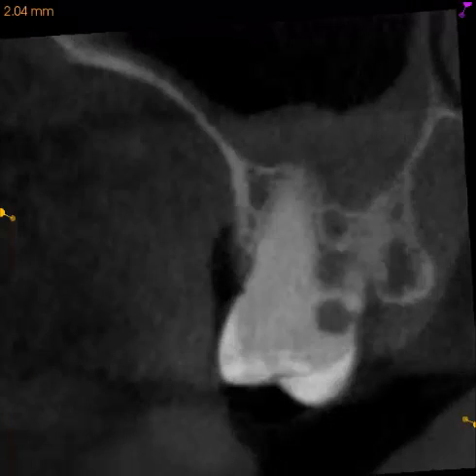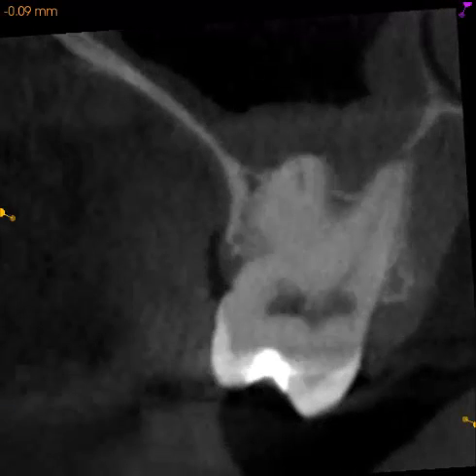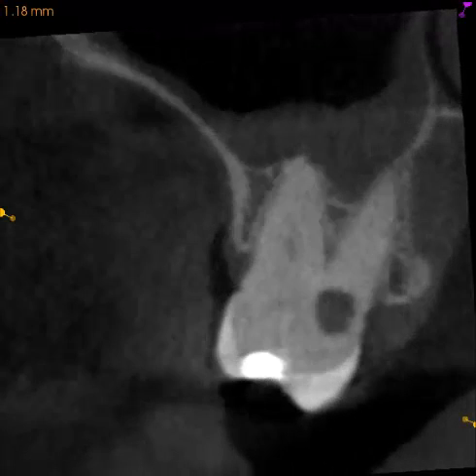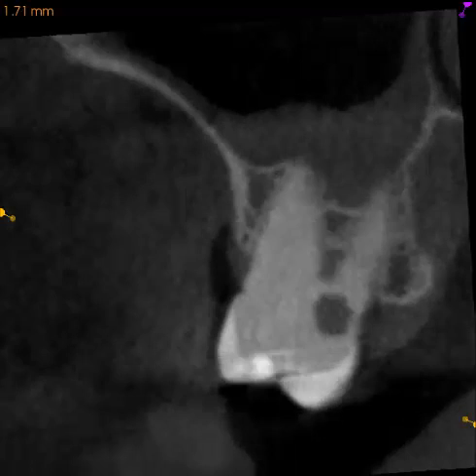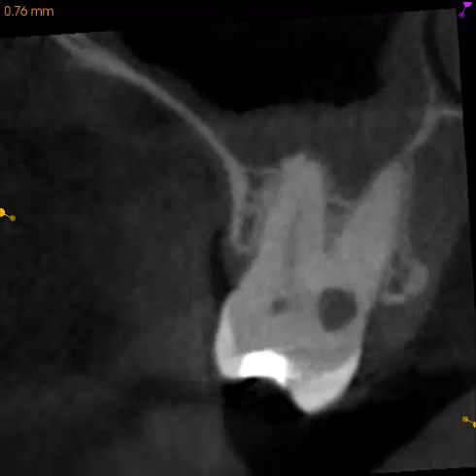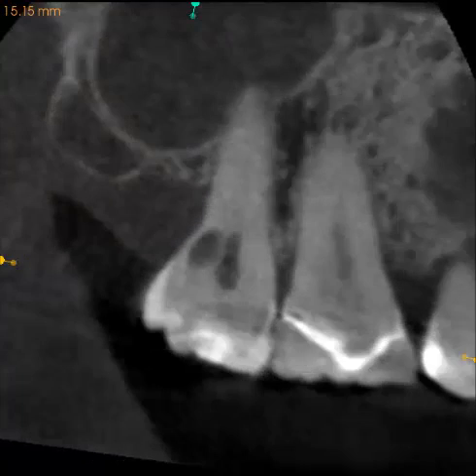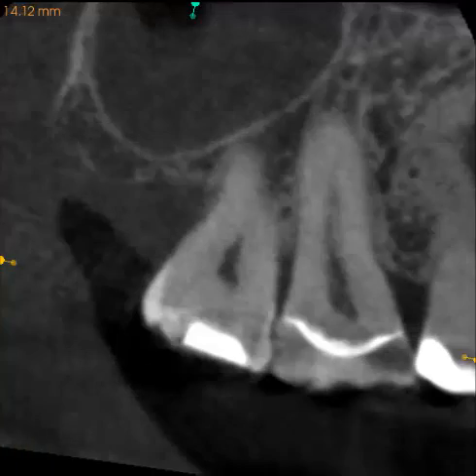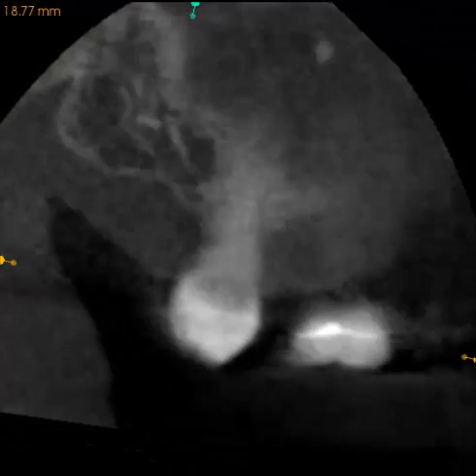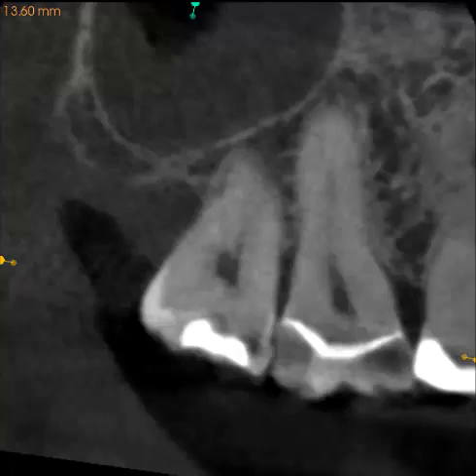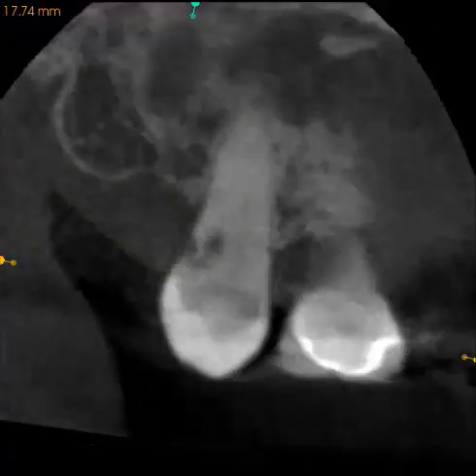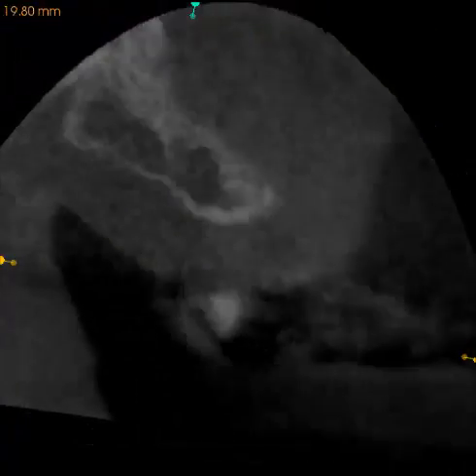Although I really like to look at this resorption defect in the transverse plane, the frontal view and sagittal view sections dynamically sliced offer some additional information through these different planes of perspective.